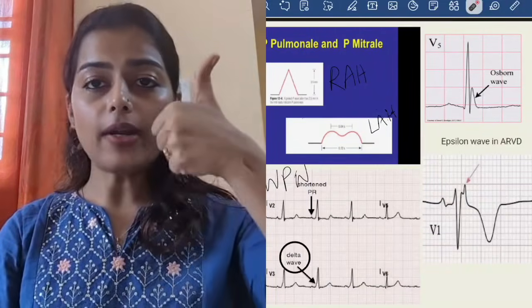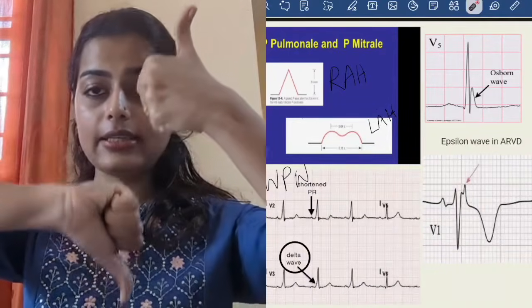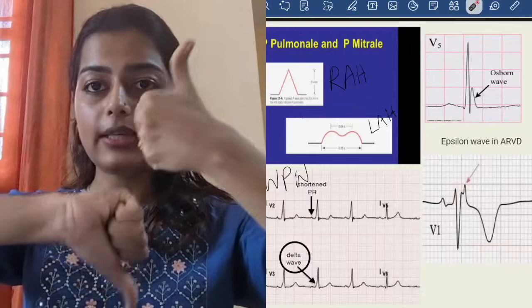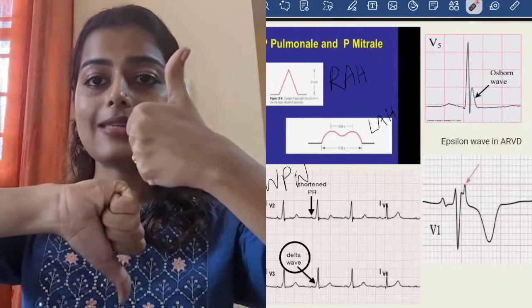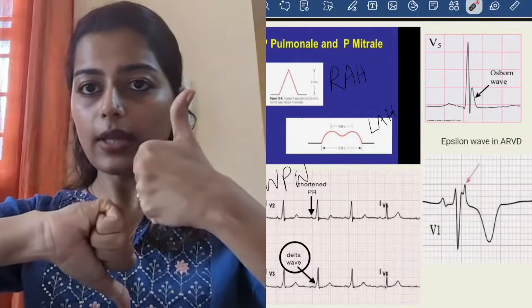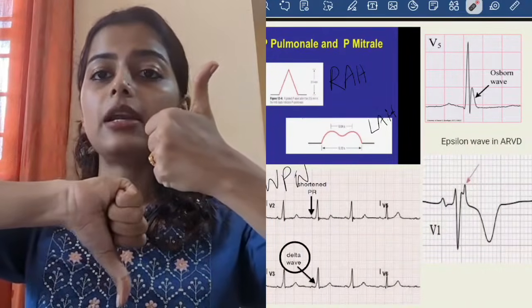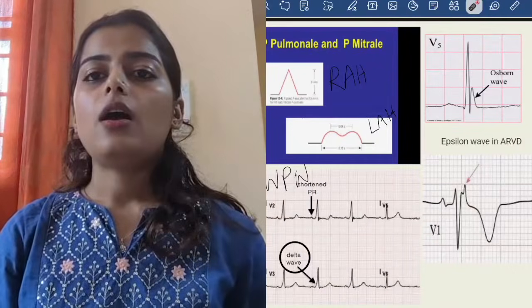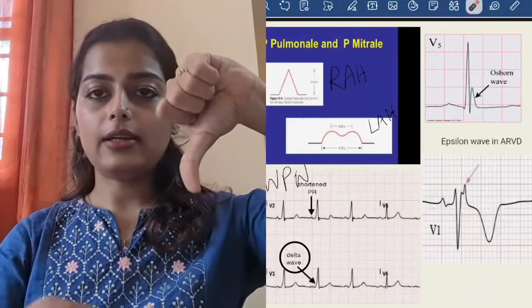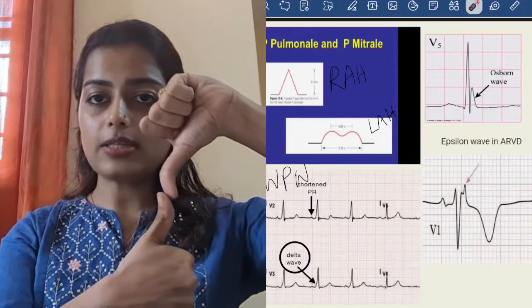When lead 1 is positive and lead AVF is negative, these are leaving away from each other. So this is left axis deviation. Leaving equals left, L for L. Third scenario, when lead 1 is negative and lead AVF is positive, these are reaching towards each other.